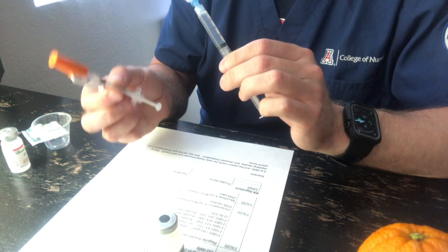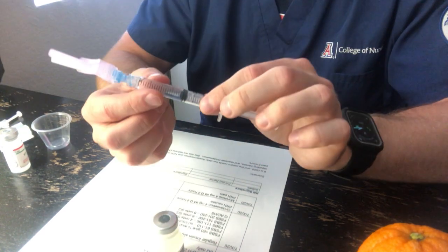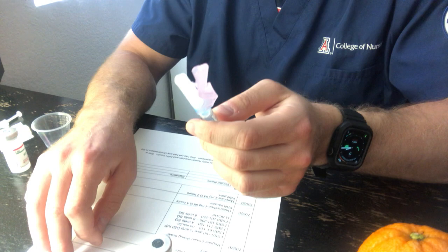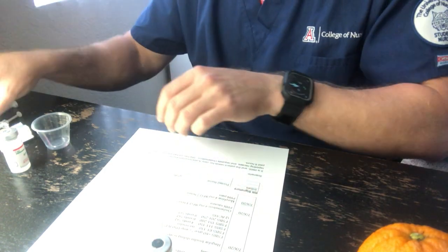label. I forgot to say I'm going to label my insulin syringe as well. I'm still in the med room, so I'm labeling my insulin syringe, my PO medication, and my IM medication. I verify again. I had the right needle for the IM injection, I had the right dose, 2 mLs for 4 milligrams. It's going to be IM, and I have labeled it before I leave the med room. I set this aside with my other medications. My vials away. So I'm done with my second check.